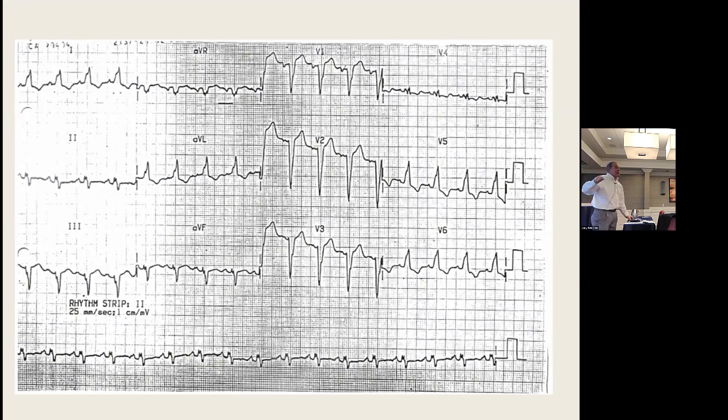But the truth be told, patients come in with this disorder and they have chest pain, and you know what we do with the EKG? You throw it away, because now you need to evaluate them in the context of everything else. Their troponins, their enzymes, other studies, because you can't reliably see ischemia on an EKG that already shows what looks like ischemia.